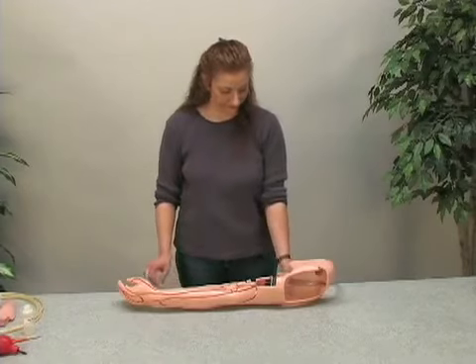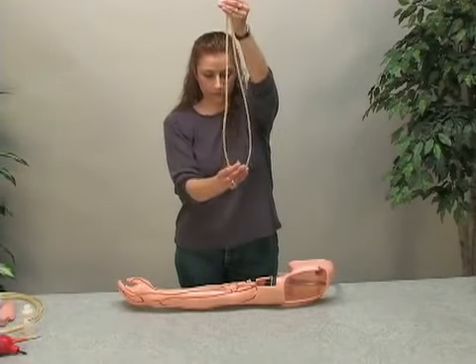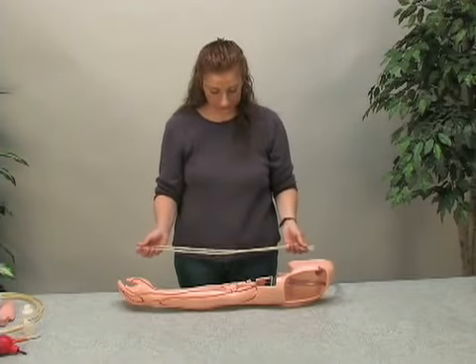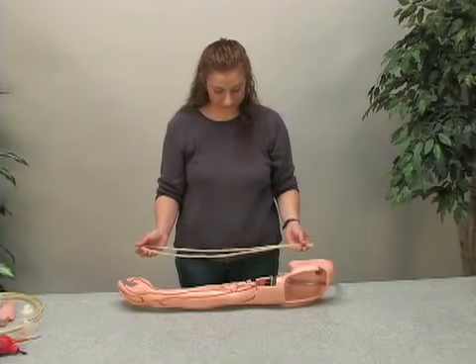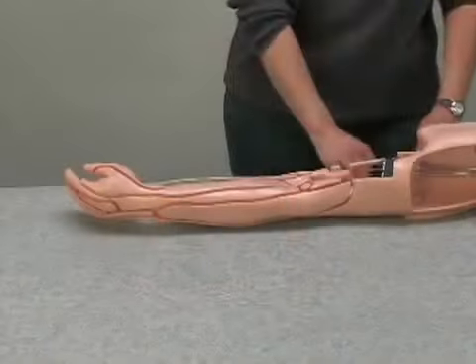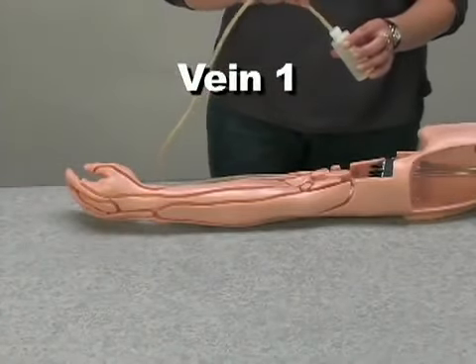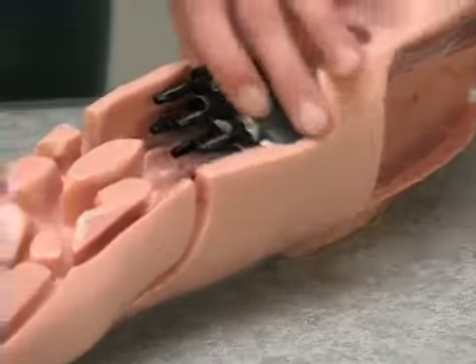Each vein contains a metal spring inside. Check that the spring is in the middle of each vein. This will prevent the tube from pinching around the fingers. Take the first vein and lubricate one end. Connect the end of the tubing into fitting number 1.